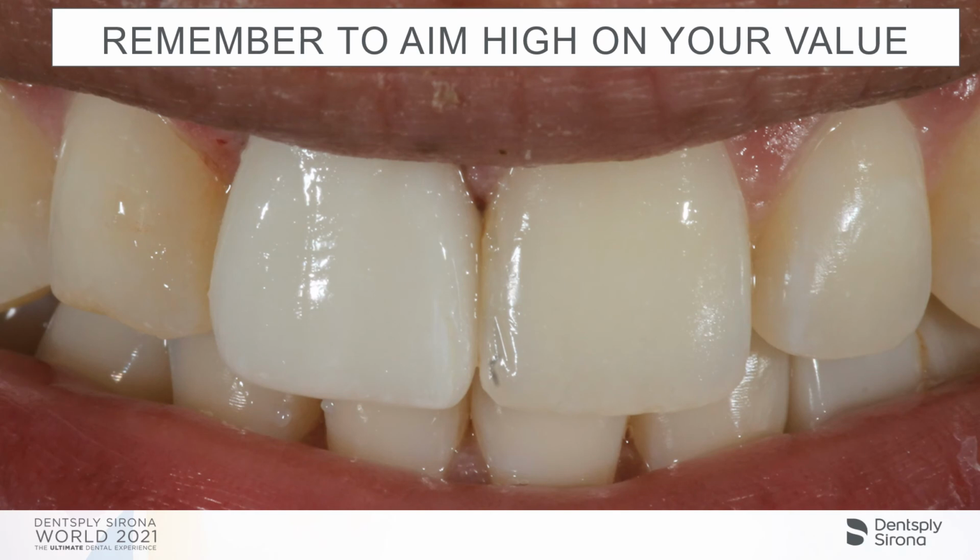Okay, so we've thought about that. Okay, so now we're still trying to mimic nature. So this patient, I wasted an Emax block. Sorry, but I did. I thought this was kind of interesting. So typically, I only mill one block. I take a lot of photos. I take pride in the fact that I aim high, and very rarely do I have to mill a second block. For this patient, I milled a second block just because I wanted to do one on a model as an example and one chairside in the patient's mouth.